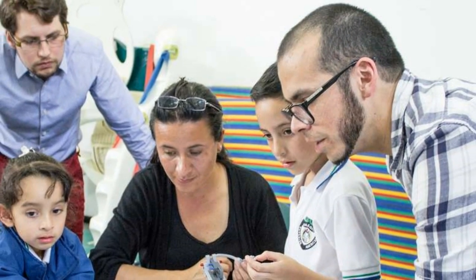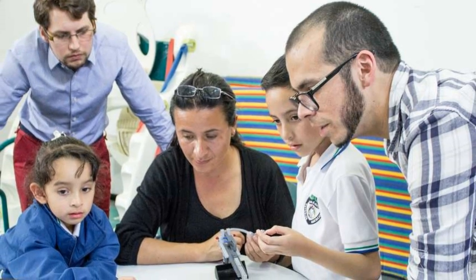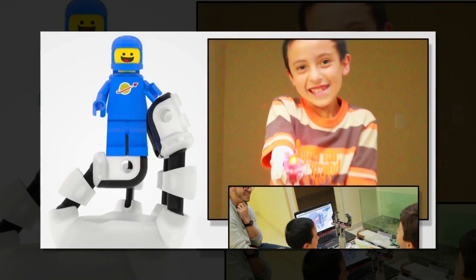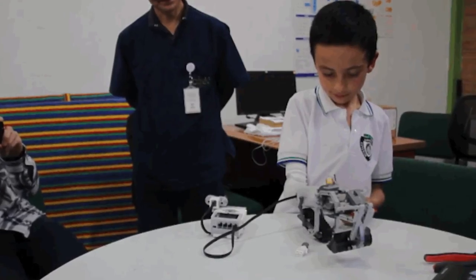For his final project at university in 2014, Torres designed Eco, a prosthetic arm for children that also acts as a platform for creative Lego projects. The project was awarded the prize for Open Design student in the 2015 CORE77 Design Awards earlier this month.